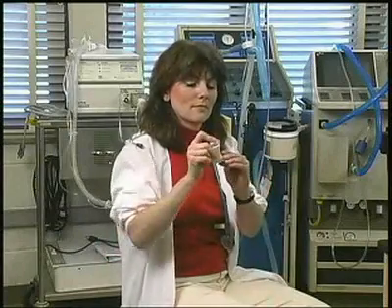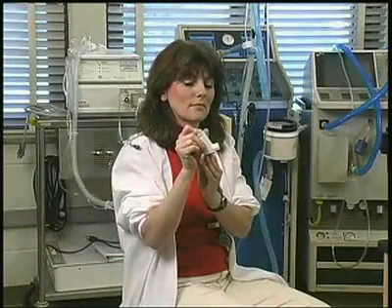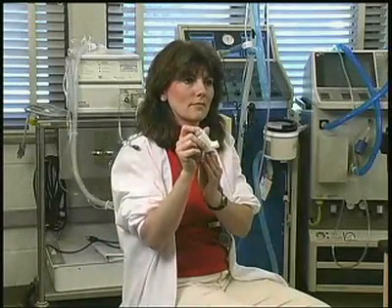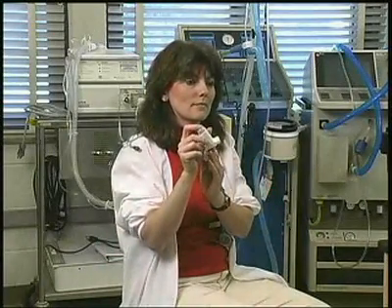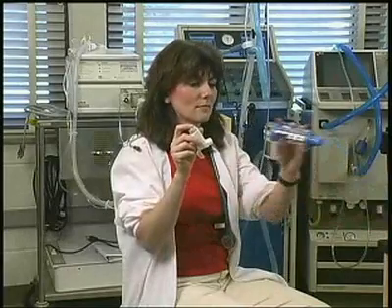To administer a metered dose inhaler or MDI treatment, first shake the inhaler well and discharge a dose if it hasn't been used for 24 hours. A spacer device is preferred to maximize lung deposition.